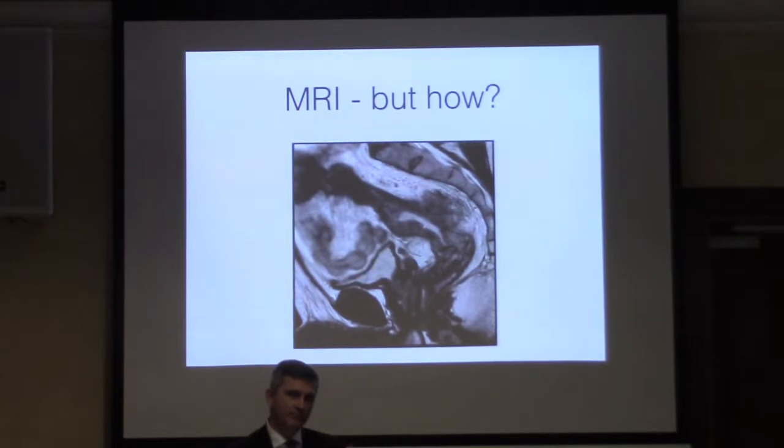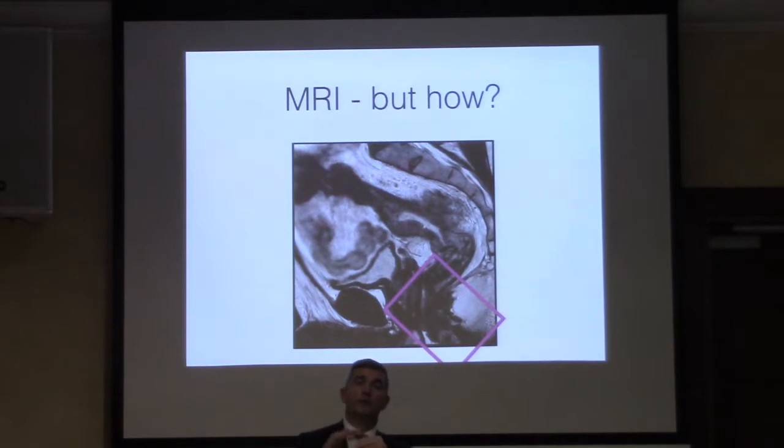And then they have a separate field of view where the rectum changes its shape. And that will then allow you to acquire, again, in a true axial of the lower rectum, and again you need another field of view which covers the low rectum, and again allows you to acquire images in the true axial plane and true coronals. So you don't get partial volume artifact, which allows you to best assess the wall.